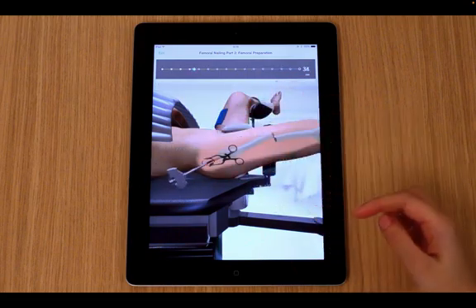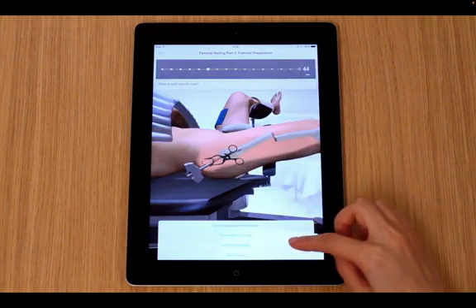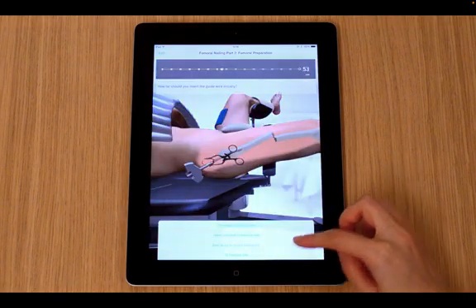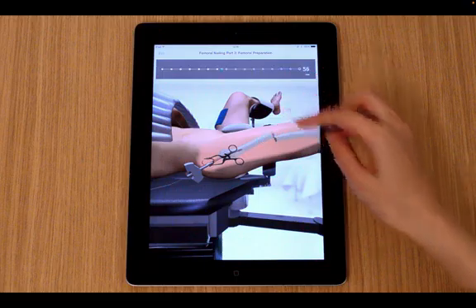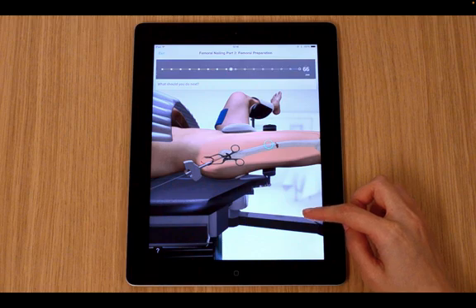to make the incision and be able to guide the awl, the guide wire, and the nail eventually, whilst answering questions step by step in order to familiarize themselves with the operation technique, so that they are prepared and know what to look out for without any nasty surprises before they go into theatre and conduct this on a patient.